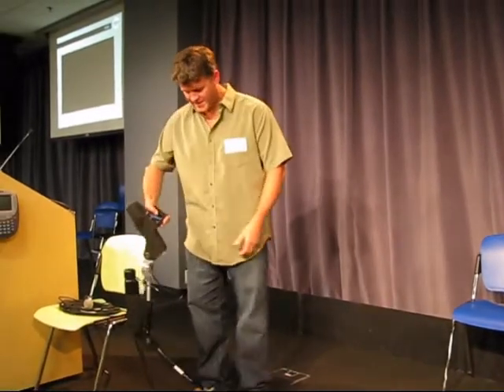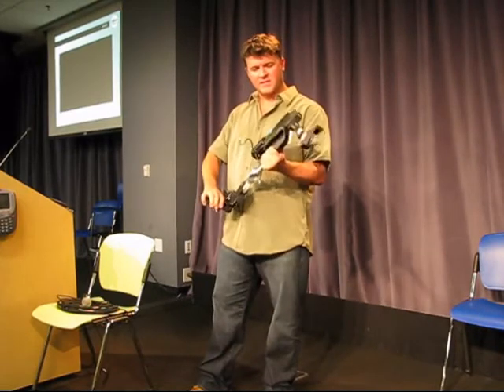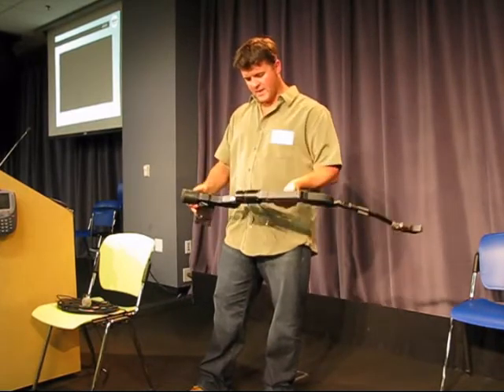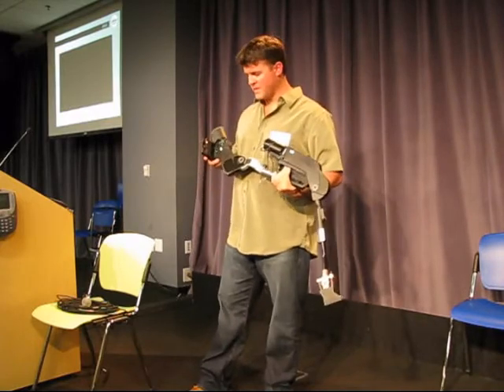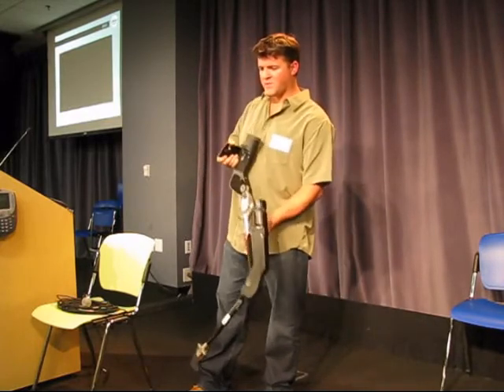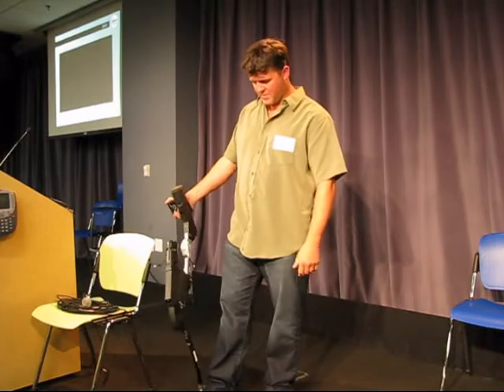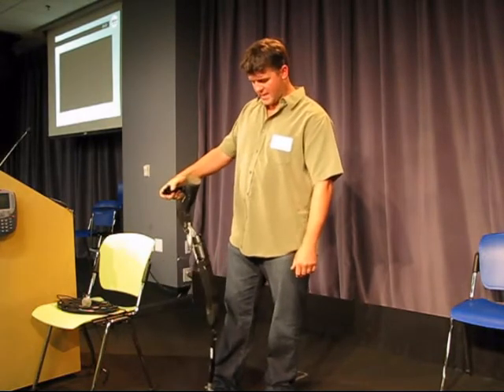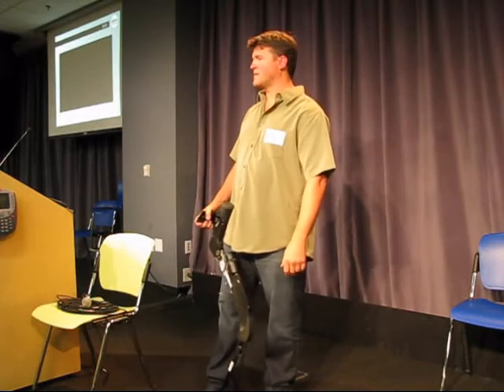So the sensor suite on here. This leg would have encoders on the knees, position sensors on the joints, and force sensors, so we know the actual joint torques. We do have a gyro suite, a series of sensors that lets us know basically where the robot is in space. We know the orientation of the exo through some IMUs and rate gyros in the back, and can calculate where it is and then do the correct control based on that.